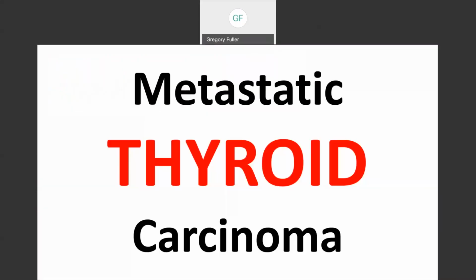So that's PVA. All right, it's highly vascular. It could be melanoma, highly vascular. It could be renal cell, but you know, the H&E of that looked like adenocarcinoma. So you think, what tumor would look like adenocarcinoma, but be vascular enough? Do we usually embolize regular adenocarcinoma of lung? No, because it's not that vascular. Thyroid is number one on your list. This is not pathognomonic. Don't get me wrong. Remember how the conference works.